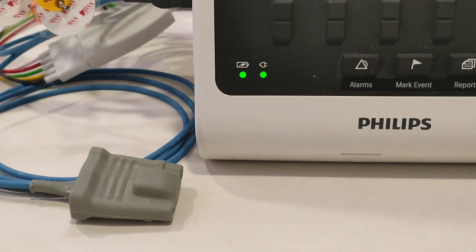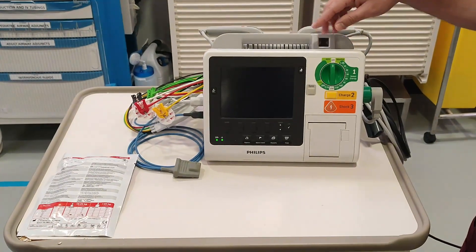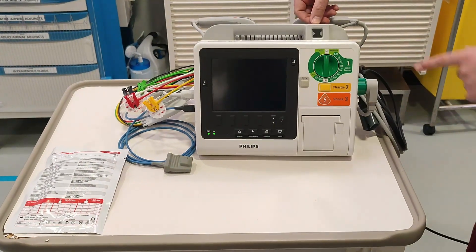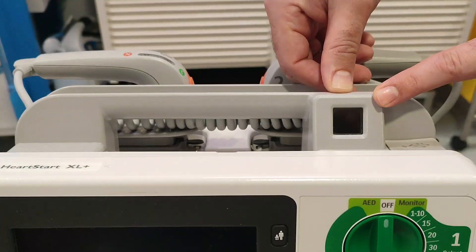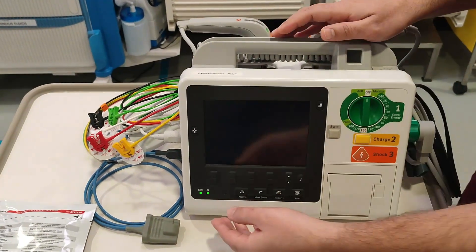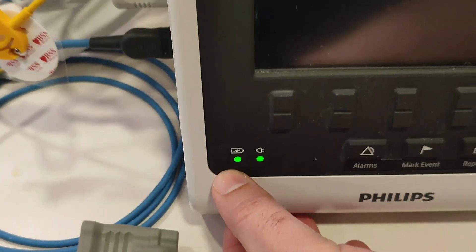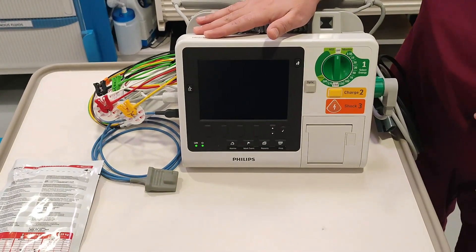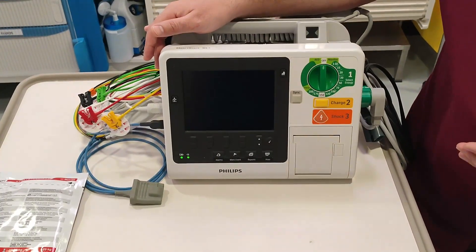Make sure every time the defibrillator is connected to the charging cable, because we need to keep it charged so we can utilize it for emergency purposes. How would you know that the defibrillator is charging? As you can see, it is getting charged electrically — this is the sign that it's connected to the cable. The plug is in there and the battery is charging, so this is how you know whether the battery is charging or not.